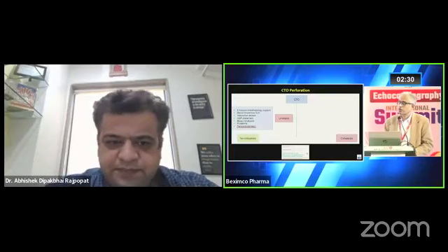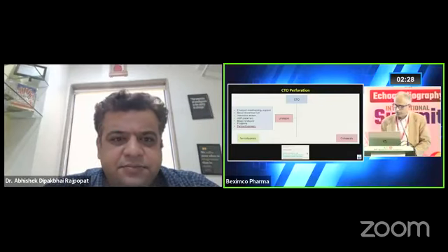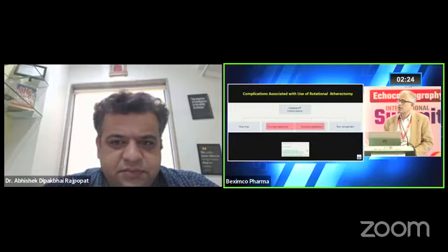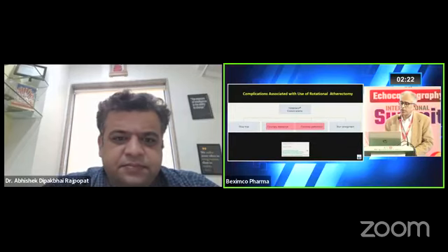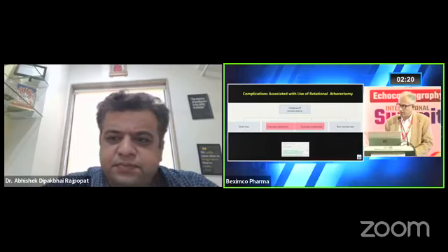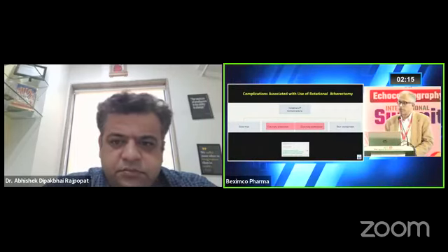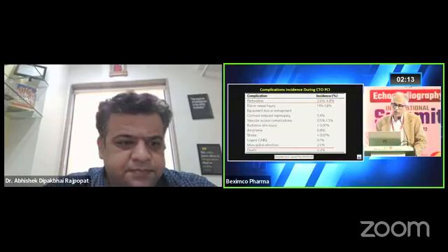So there's a lot of improvement in terms of the technique. There's more focus on the CTOs in terms of how the rota is used. So here, what are the problems that can happen? During the rota, coronary dissection can happen, perforation can happen, and again, similar complications in terms of pericardial effusion. So these are the incidences in terms of the perforation.